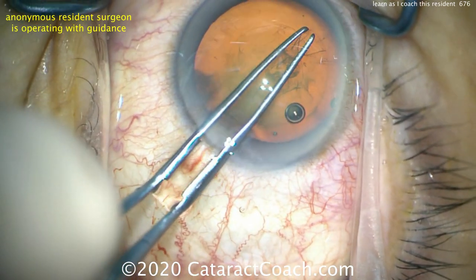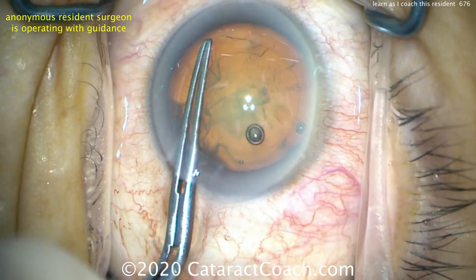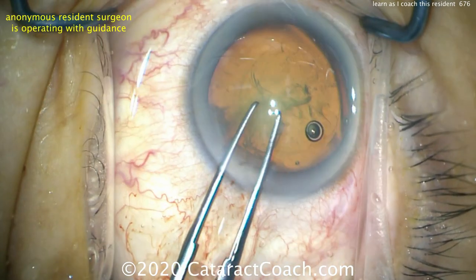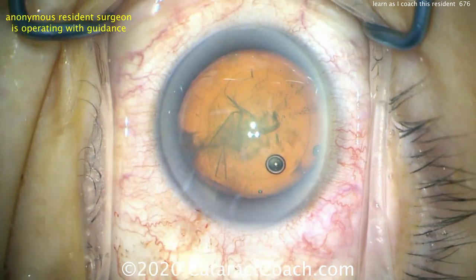So that's a little preview of what it's like in the operating room. I do demand that residents come into the operating room prepared for surgery — plenty of practice, they've read about the case, they know their patient inside and out. I want to help every resident become the best surgeon that she can.